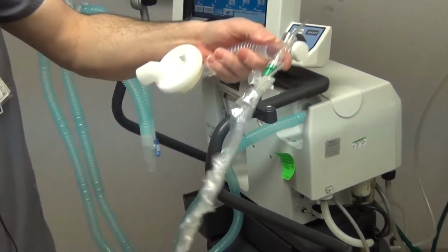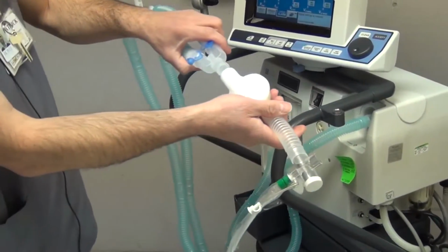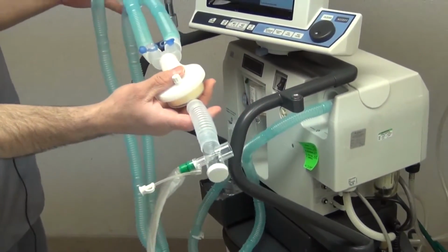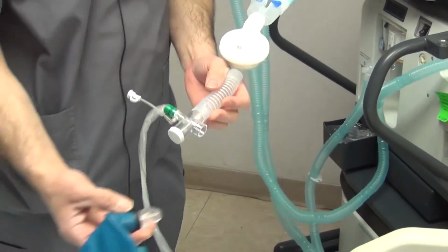So you would extend, there we go. Then you would put this on the end of the tubing, making sure again these are still plugged. And once you have that all set, you would connect it to the patient.